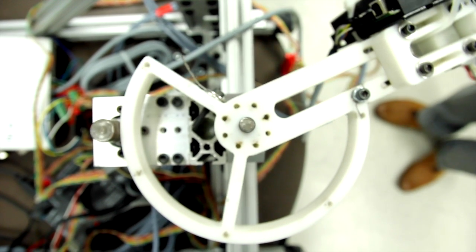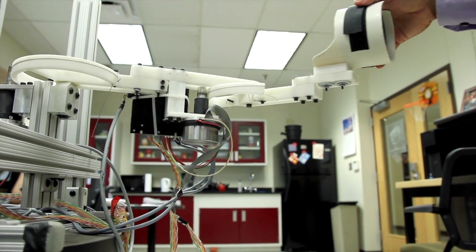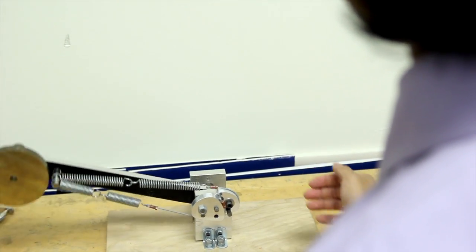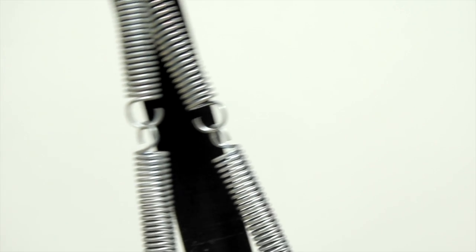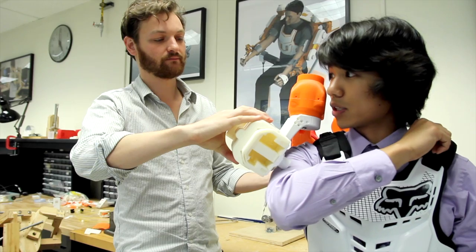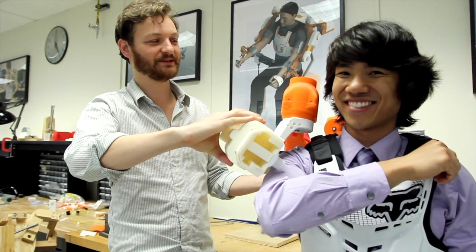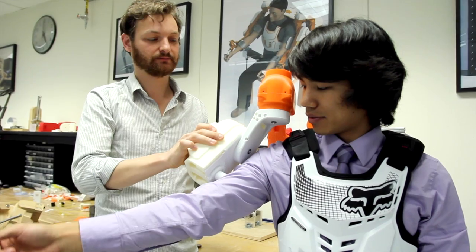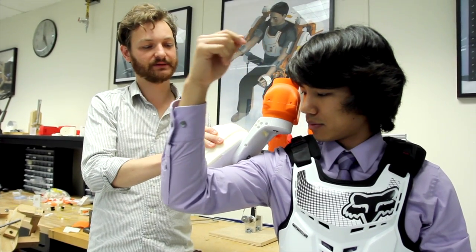Force sensors can tell how much force the patient is applying on the robot as they go through the therapy sessions. It can have customized resistance to allow the patient to do different exercises to help rebuild the muscles. And finally, it's fun — it's something unique, different, and new to the rehabilitation process, and it gives patients something to look forward to when they go through their therapy sessions.